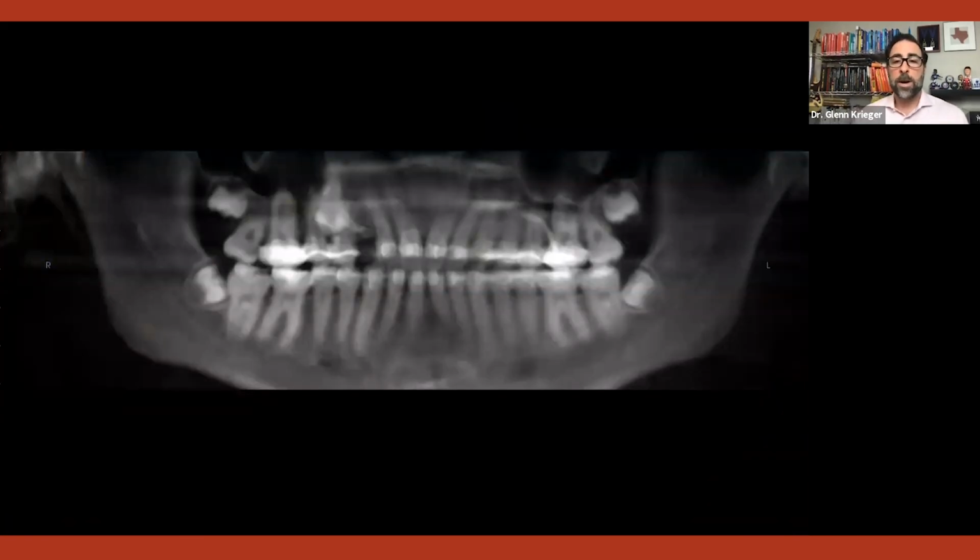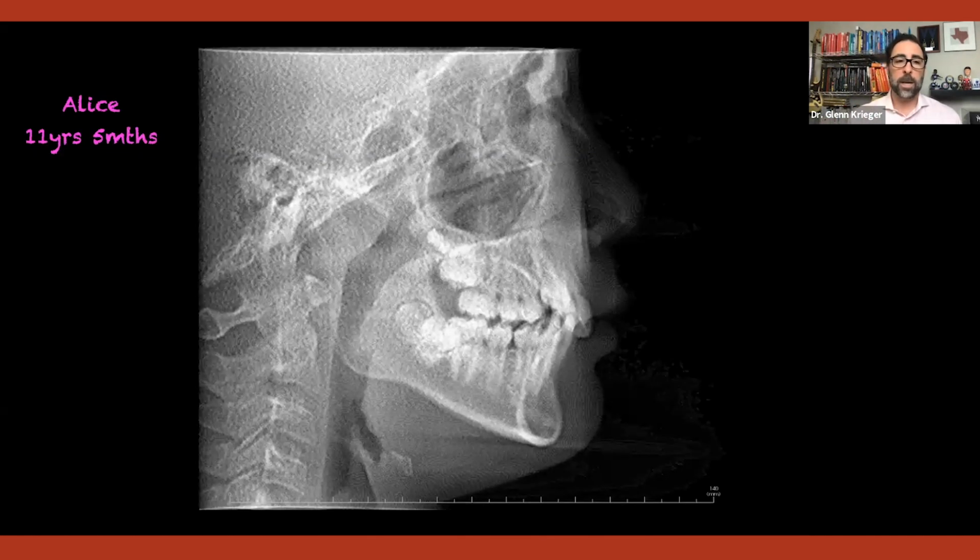Again, this is what I would ordinarily be working on with a CBCT. And as we know from more than 1 or 2 studies, if upper anterior teeth are proclined, you're going to start seeing some interesting artifacts on a panoramic x-ray. Oftentimes, if they're really proclined, you're going to see what looks like root shortening when in fact it's not there. So again, this gives me peace of mind when I go to my CBCT and look at things.